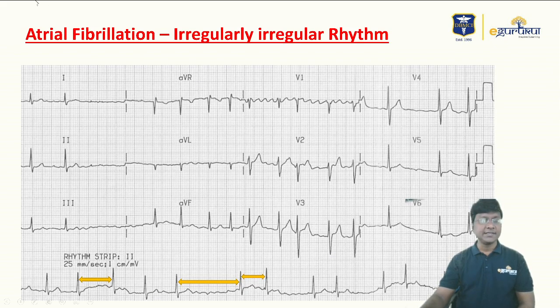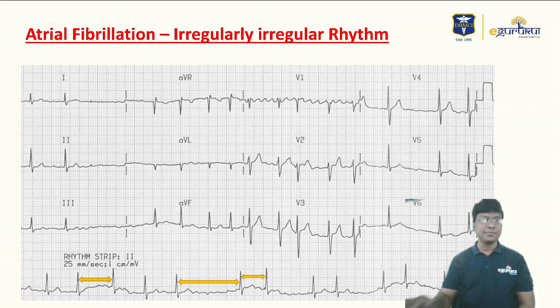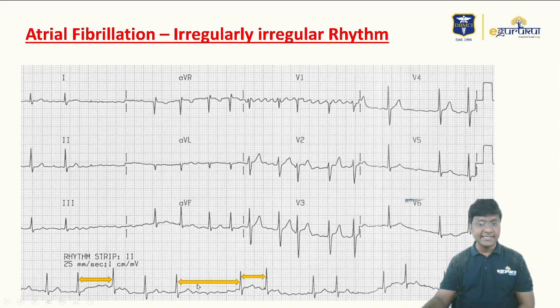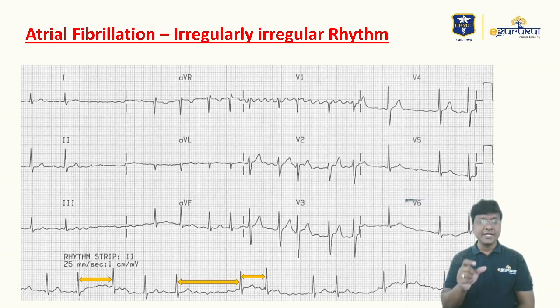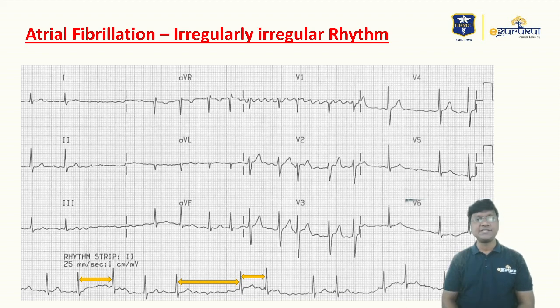In atrial fibrillation, the key finding is an irregularly irregular rhythm with a variable RR interval. I've marked the variable RR intervals with yellow arrow marks. Additionally, there is an absent P wave and the presence of fibrillatory waves — these are the ECG changes in atrial fibrillation.